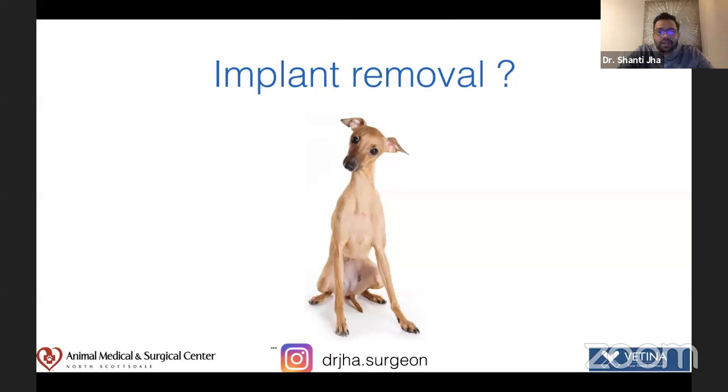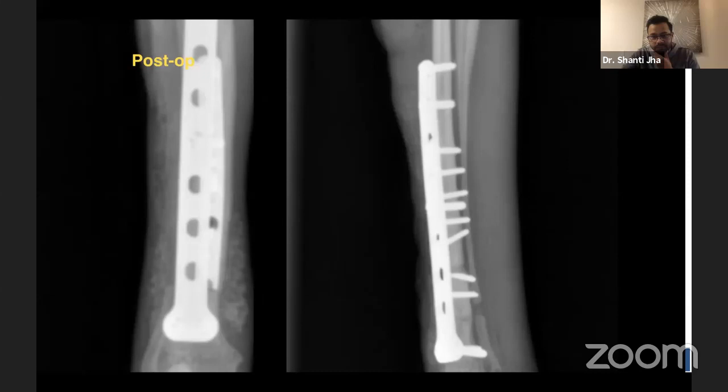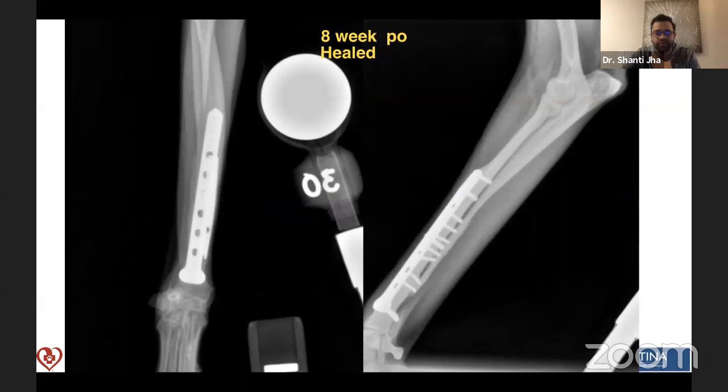So I went in and tried to remove the implant, but I think I would be causing more damage to remove it because it was so difficult to even find the screws. Everything was white periosteum, and it was so hard to see the screws. So I just plated on top of it, a different plate, a little bit longer, and went from there. Bone graft was used for those screw holes here and there. This is 8 weeks post-op, healed, and the dog is doing well.